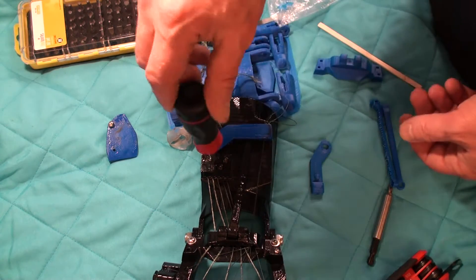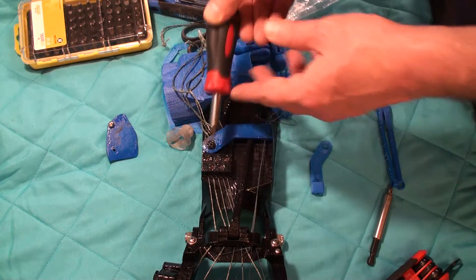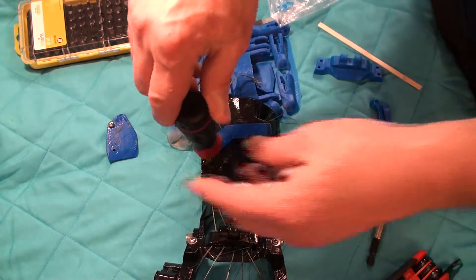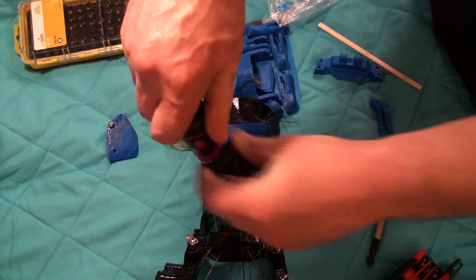We're following the middle finger, so this is where the set screw is — the set screw for the middle finger. I'm just going to take that out.